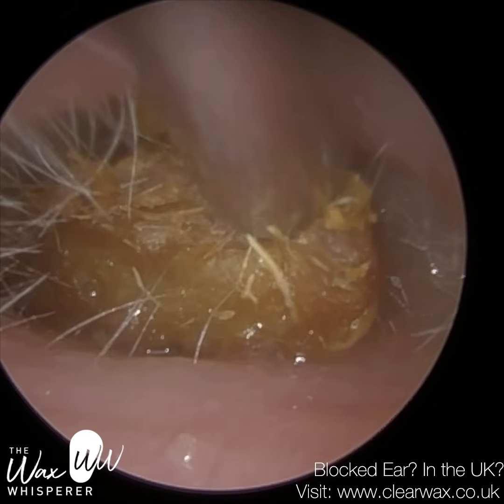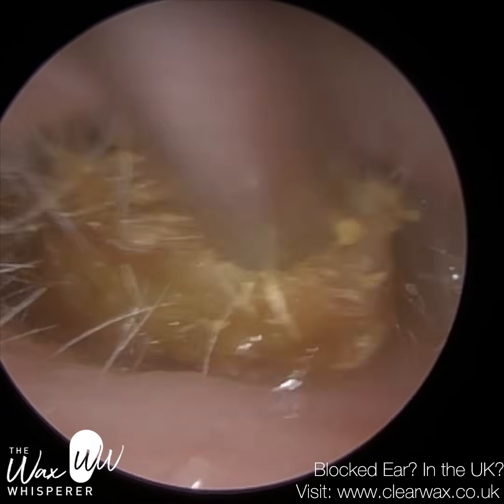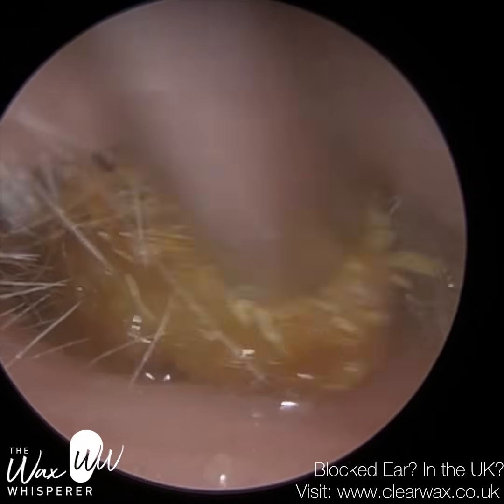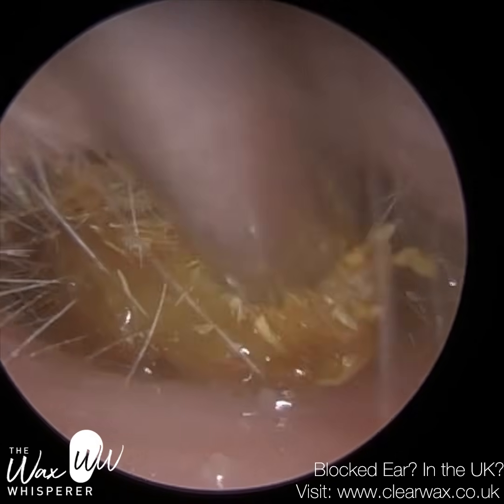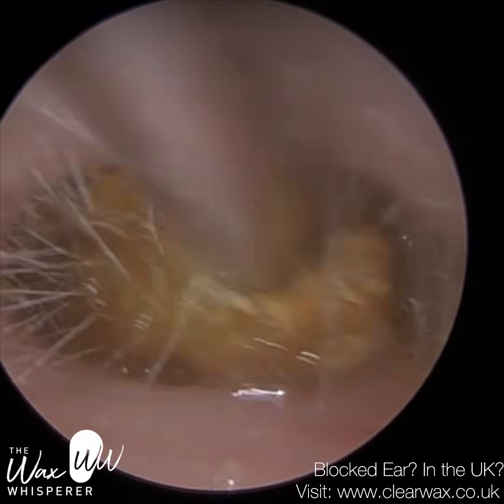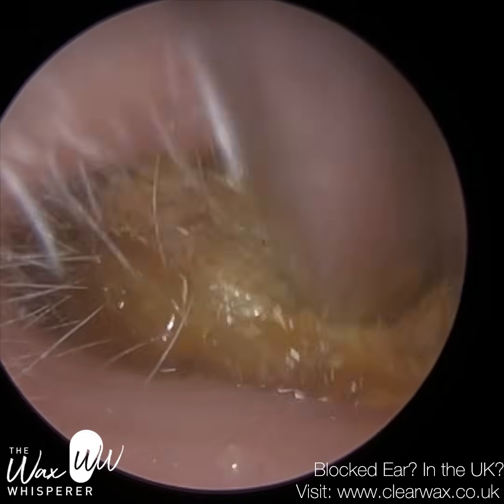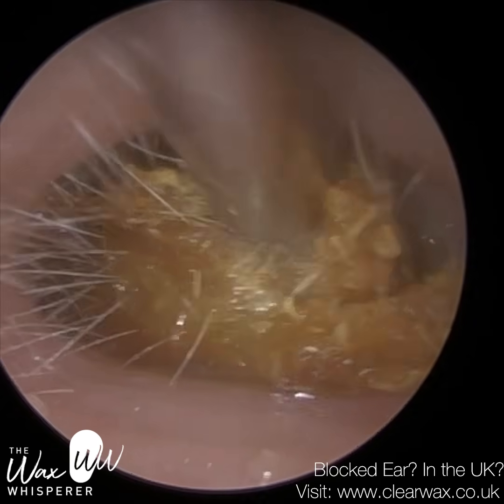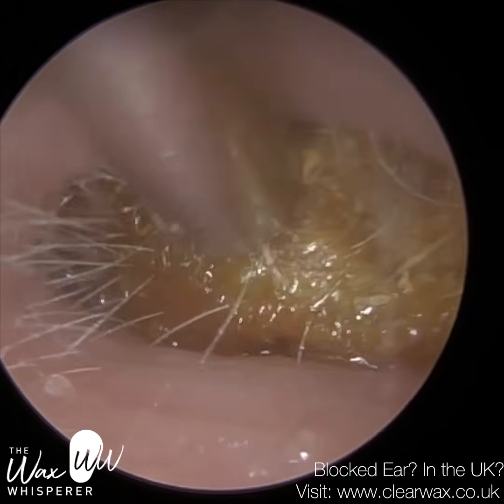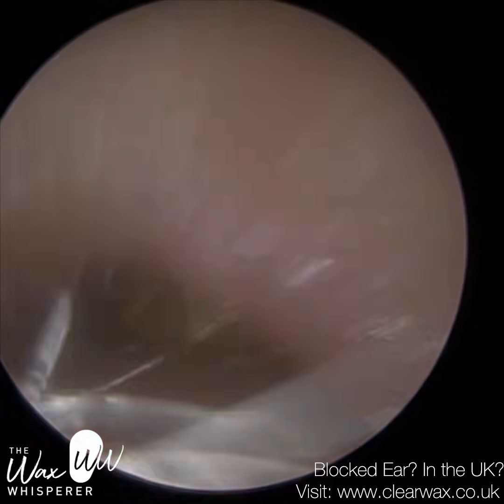And then the innermost layer is the subcutaneous layer, which is a layer of connective tissue and insulating fat. Once you're more than a third into the ear canal, on the bony section of the ear canal, you've just got the epidermis layer, which is the outermost protective barrier. So the skin that lines the bony part is extremely thin and delicate, hence why the bony part of the ear canal is very sensitive. If you've been watching my videos over the years, you know I stress that point. So if we're working on the cartilage portion, because cartilage is a bit more flexible than bone, you've got a thick layer of skin as well protecting the cartilage, we can apply a bit more pressure. But when we're working on the bony part, deeper in the ear, we're just going to be really careful.